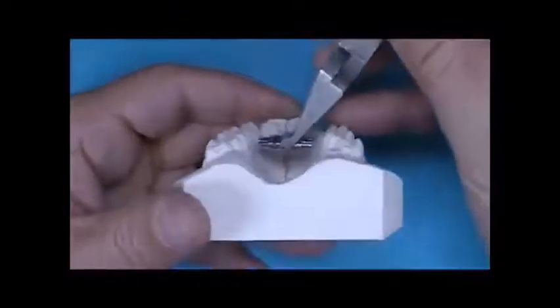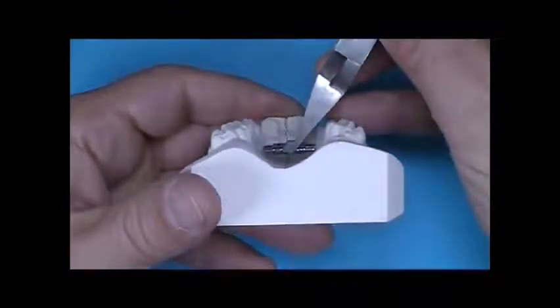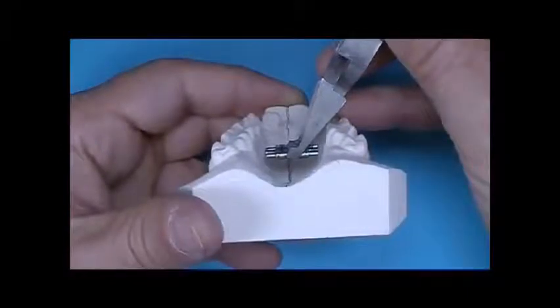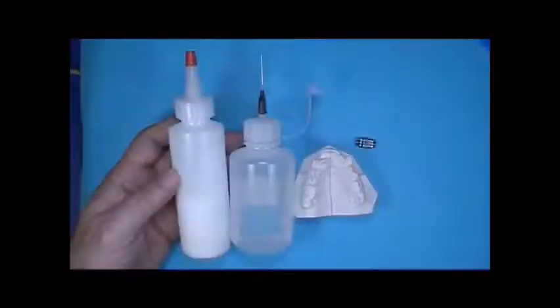Finally, the screw will be placed as deep as possible into palate while maintaining a 1mm gap to tissue. Also, top of screw will be parallel to occlusal surface. The screw placement will be held by applying a thick buildup of acrylic resin.